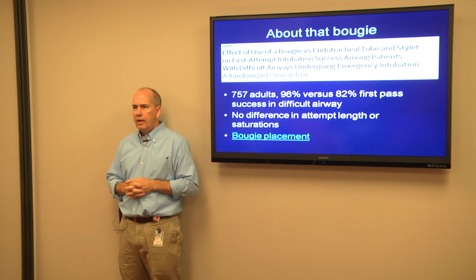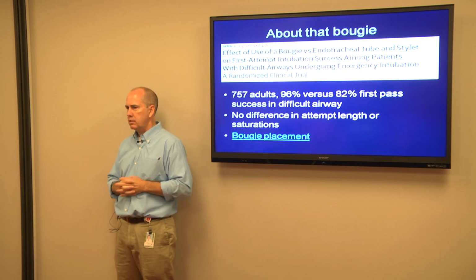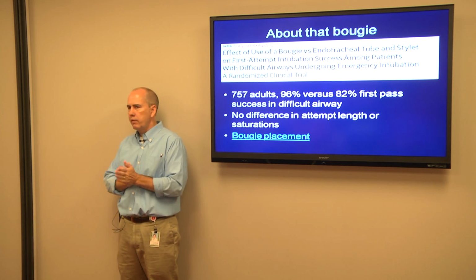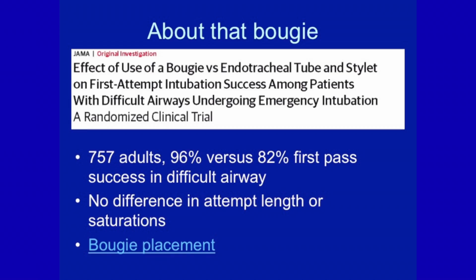And then about that bougie. Who's used a bougie for their intubations? Great, and I hope all of us can say we've done that. There's now a great adult study that came out in JAMA that showed improved first pass success in difficult airways, but they also had a subgroup that was non-difficult airways, which is much more likely with a bougie. Adult data, but 96% versus 82%, without any difference in attempt lengths or saturations. So how do we do that?